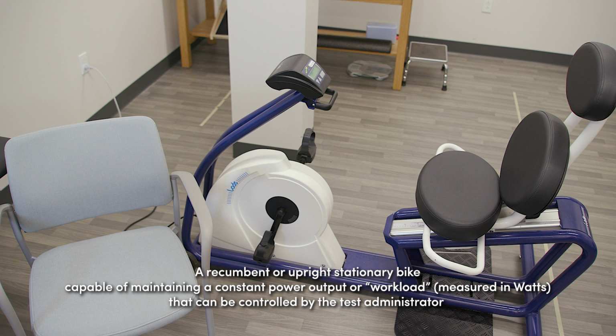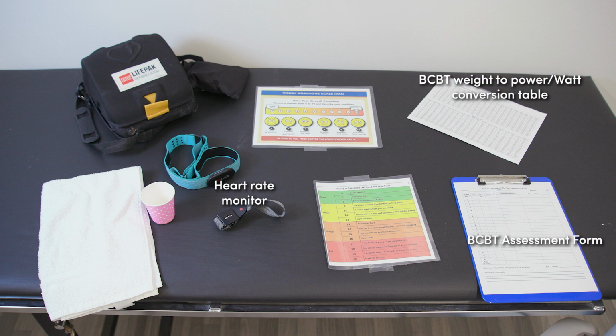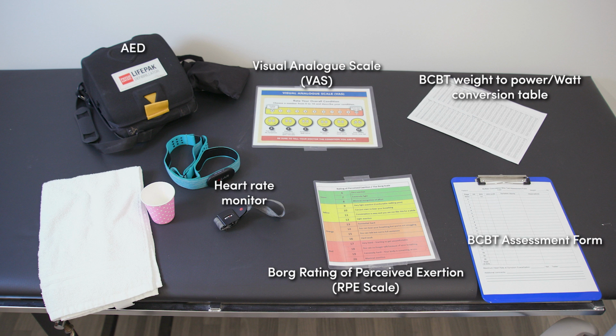A recumbent or upright stationary bike capable of maintaining a constant power output or workload measured in watts that can be controlled by the test administrator. A heart rate monitor, we recommend a Polar OH armband or chest band. The BCBT assessment form found on our website. The BCBT weight to power/watt conversion table found on our website. A visual analog scale or VAS, a Borg rating of perceived exertion or RPE, an AED, a chair, water, and towel for patient recovery after exercise.